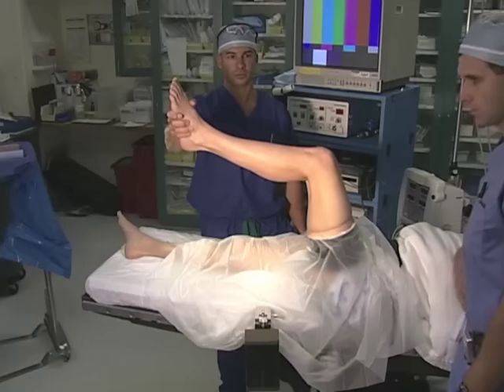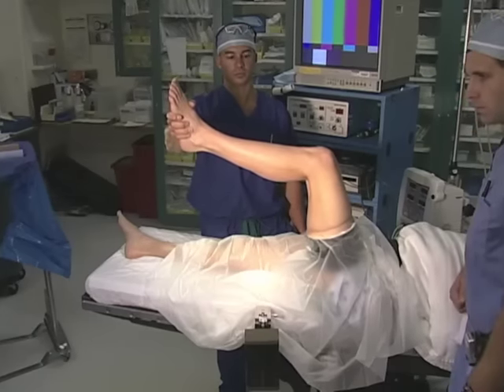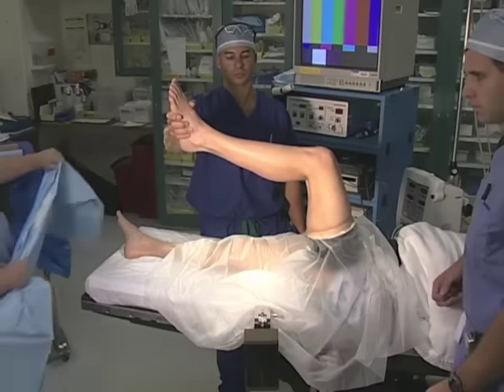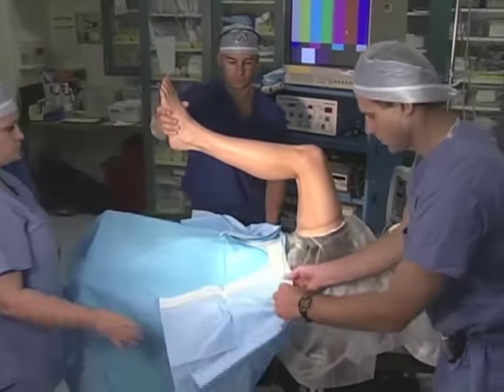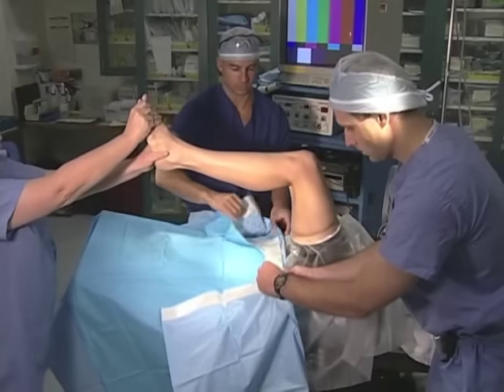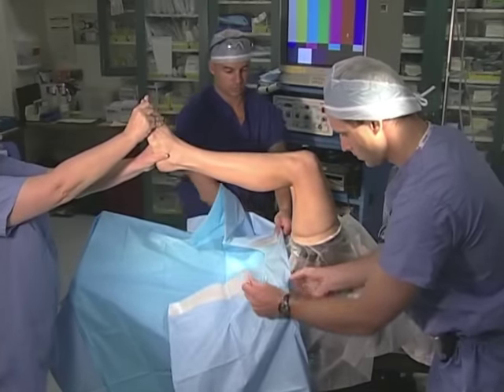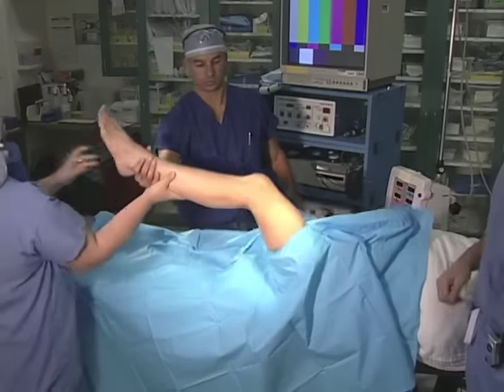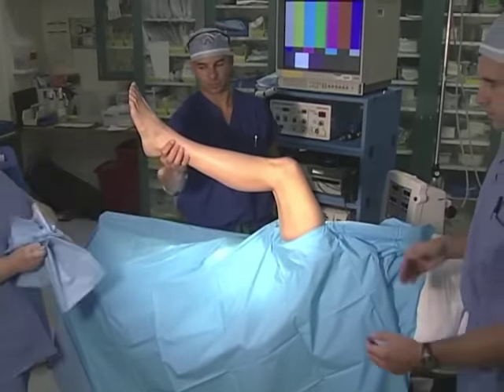Now we are going to demonstrate draping for knee arthroscopy, which is performed in layers. With an assistant holding the leg, the first layer is applied by affixing a sticky drape, first with the tails going up. Next, a second sticky drape may be applied with the tails facing down.